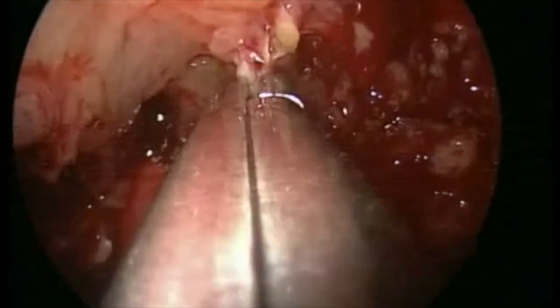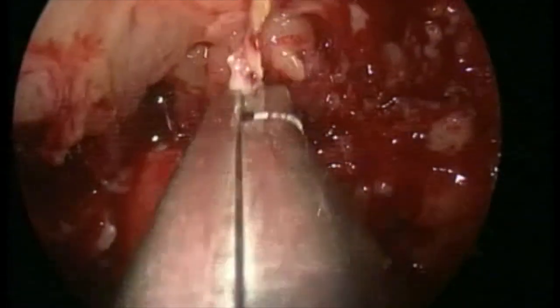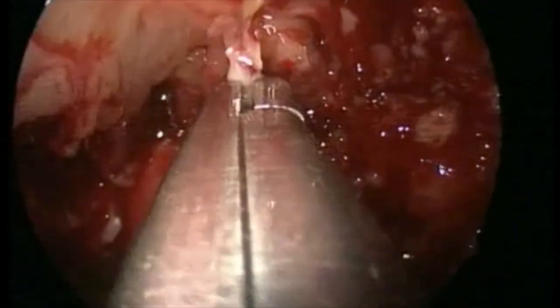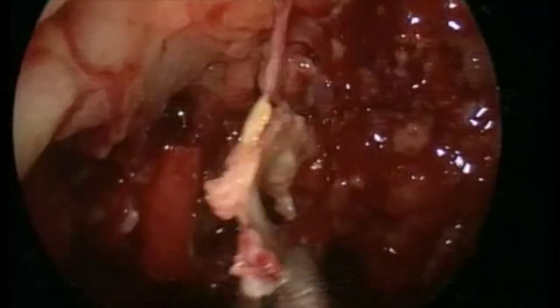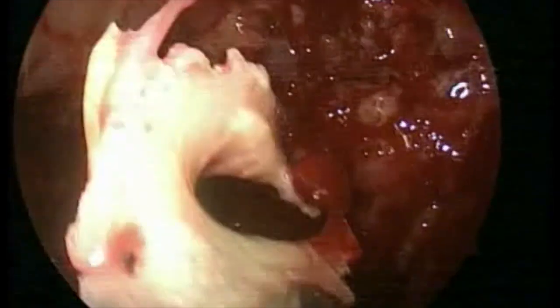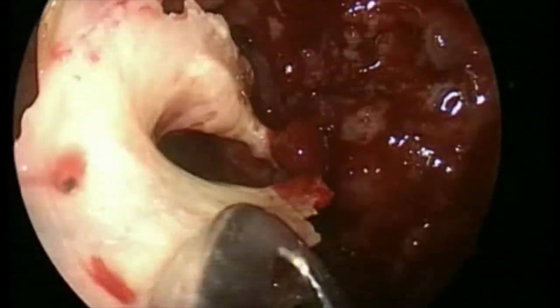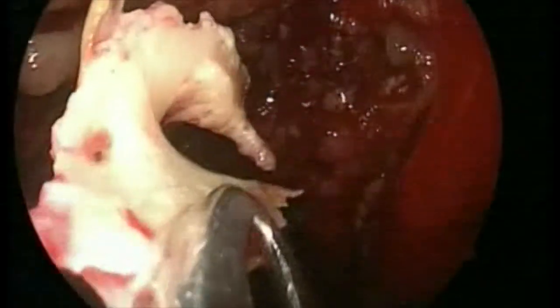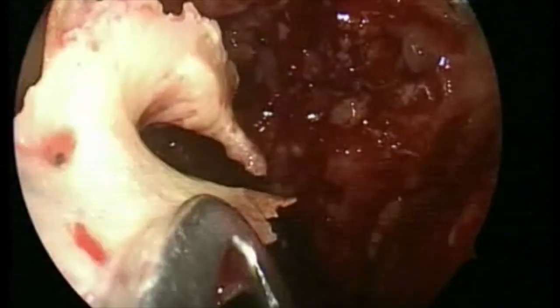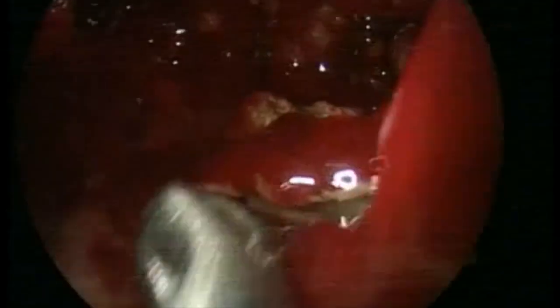Now the left side. This is the left side anterior clinoid process and the optic canal being removed. You are seeing the optic canal there and the anterior clinoid process. Gently you manipulate the necrotic bone, turn it around, free it, remove it.